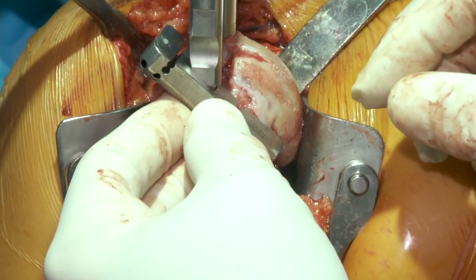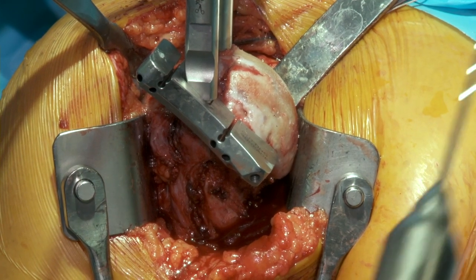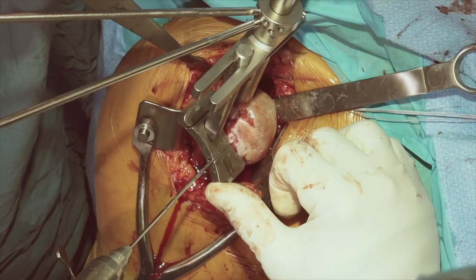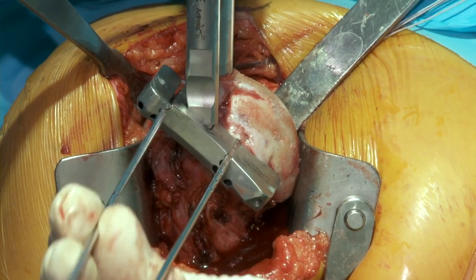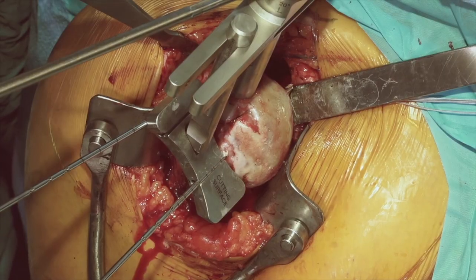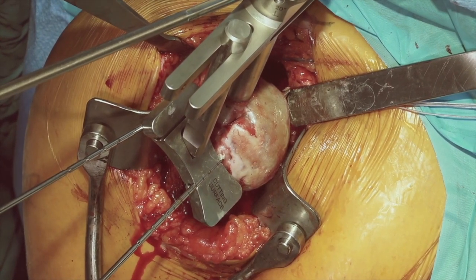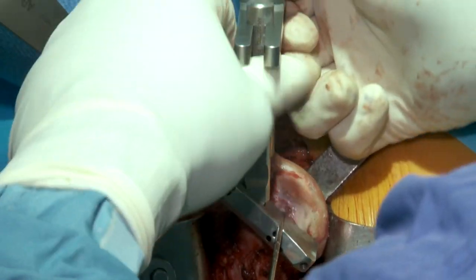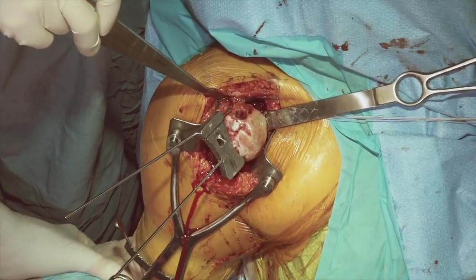This is dialed in for the 135-degree inclination. With the guide lined up with the forearm and our inclination in place, we're down the humeral canal and have a good overall alignment. We'll place our first guide pin across — I can see out the back to ensure we're not causing harm to other tissues. Our second guide pin will go off the top of the humeral head, and we have a diagonal guide to help capture the humeral head for our cut. We'll take out our retroversion guide rods, disconnect and slide off the cutting guide, remove our central reamer with a T-handle, and make our saw cut. These are breakaway pins which give us better access down to our cutting block.